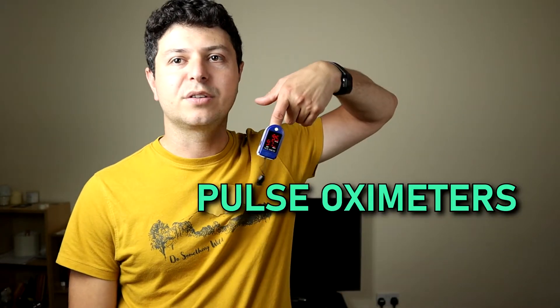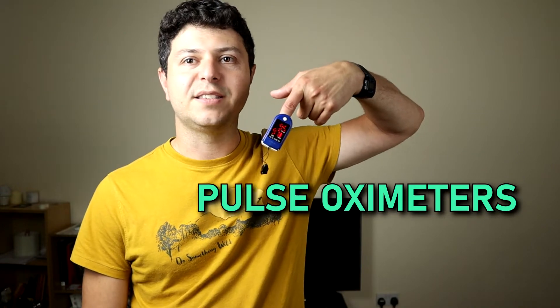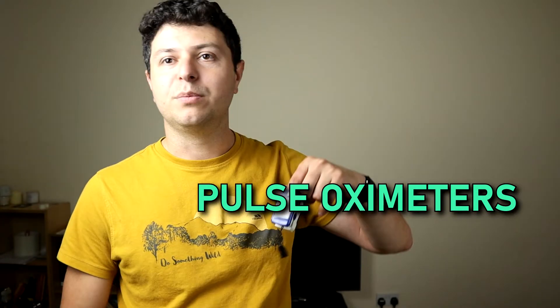Hi everyone, this is Dr. Stefan. In this video I'd like to talk about pulse oximeters — these little devices that many people buy to monitor their health. They've become hugely popular during the COVID outbreak because they've been handed out by hospitals or bought from pharmacies, health stores, and supermarkets. They're quite readily available and very useful — we use them in the clinic all the time — but it's important to understand what they measure and how to use them correctly.